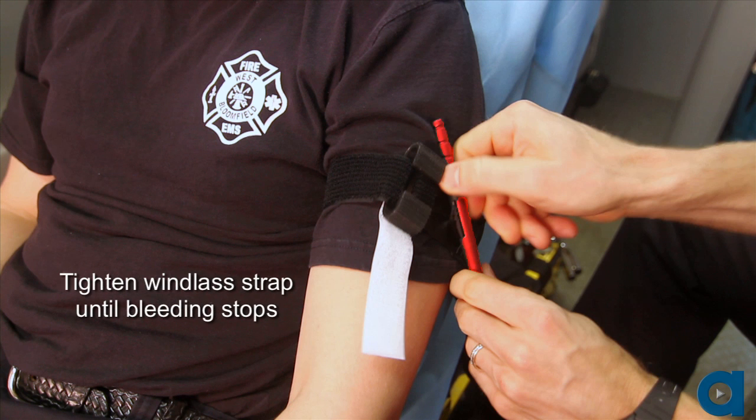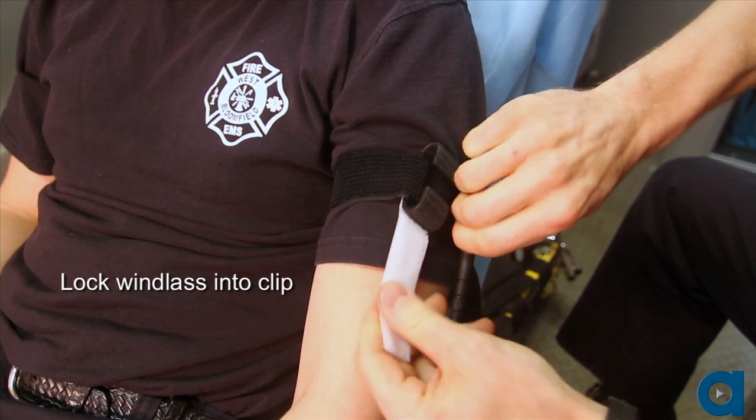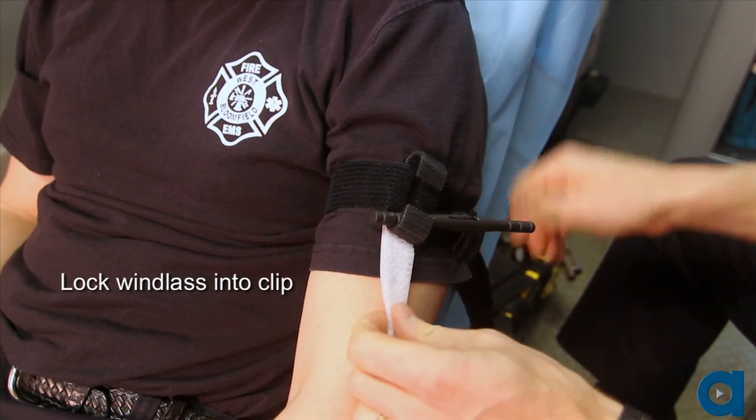Tighten the windlass only until the bleeding stops. If the victim is alert, they may complain of pain from the tourniquet. Do not remove or loosen the tourniquet, and do not allow the victim to loosen or remove the tourniquet. Lock the windlass in place using the windlass clip.